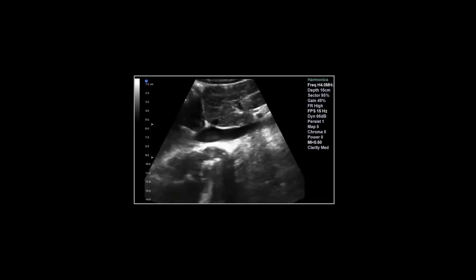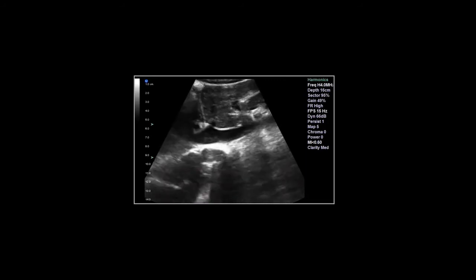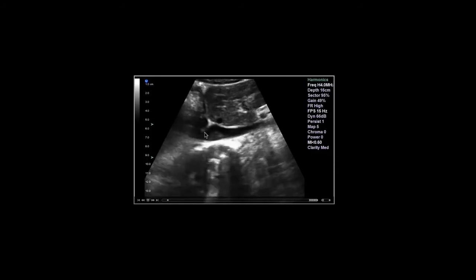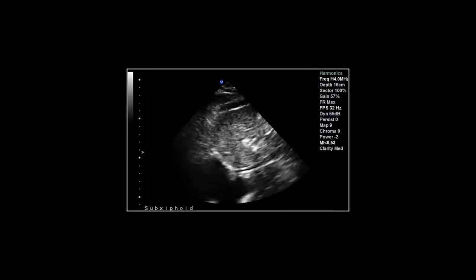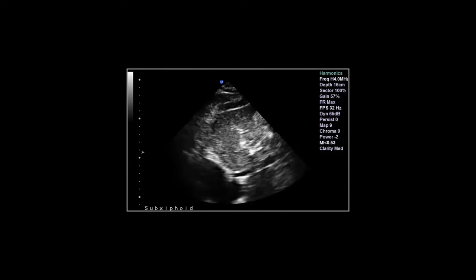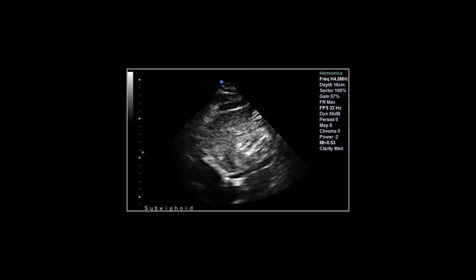In this B-mode ultrasound, we see the same type of finding. With tidal inspiration, we see nearly complete collapsibility of the IVC, RA-IVC junction, and then we're measuring right about there. In this case, we barely even see an IVC, which of course collapses with inspiration. Down here, a very, very small IVC, very small diameter that with inspiration collapses.